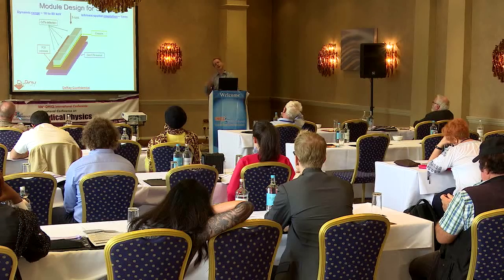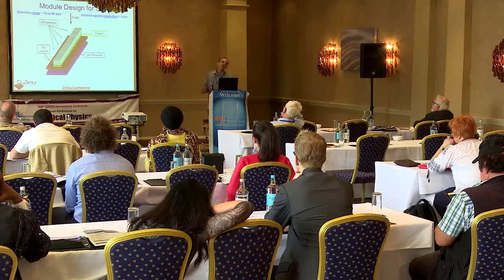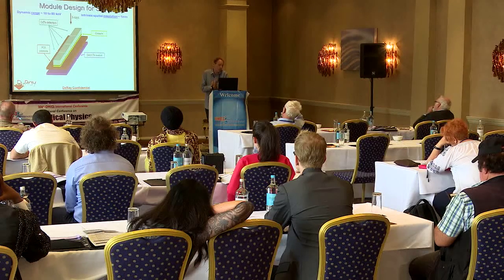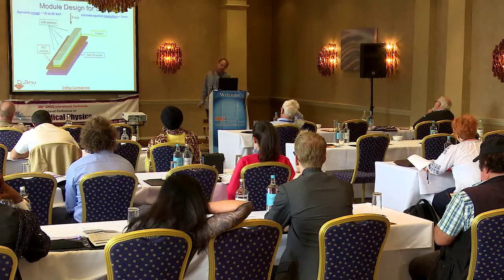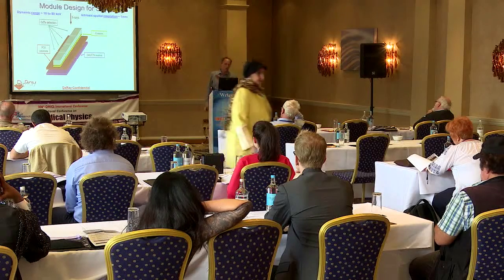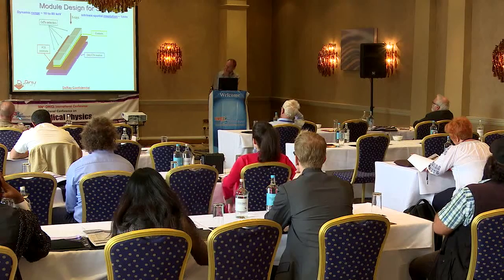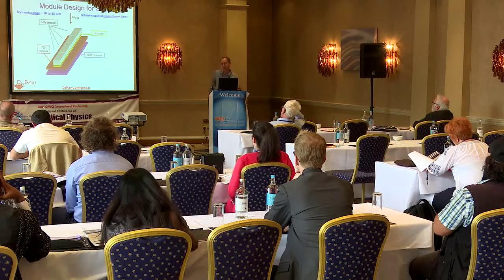Okay, so this photon counting method, it's not just applicable in CT. It's also applicable in spectral X-ray absorptiometry. Now, this application is usually done for bone mineral densitometry, or also body mass index scans. So BMD or BMI imaging is done.